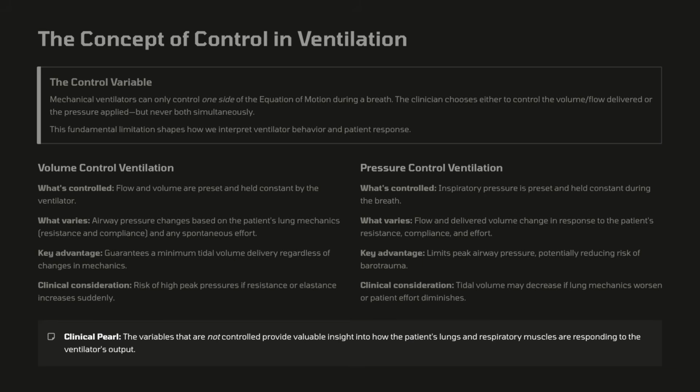The main problem or the confusion that people have is in PRVC mode. They think you're regulating everything. No, actually not. The pressure that needs to be given is determined by the volume controlled breaths which are initially given, but ultimately the breaths that are delivered in the PRVC mode are pressure controlled breaths. So there is a possibility of the tidal volume not being achieved in PRVC, especially if your peak pressures are going high. So that must be kept in mind.